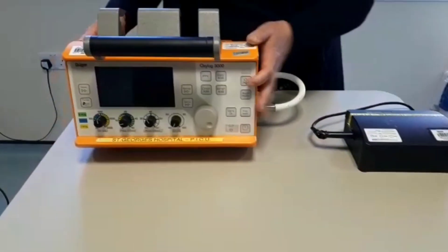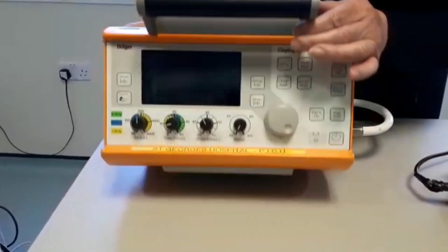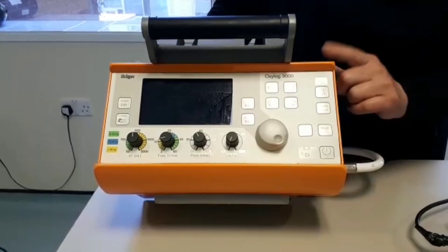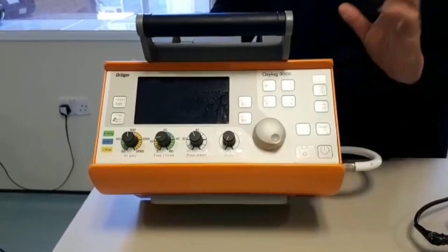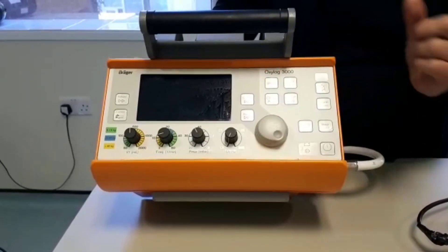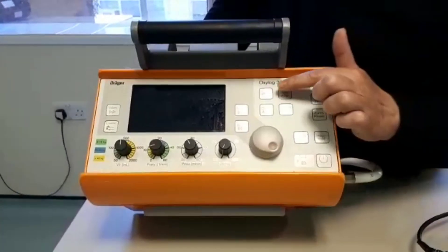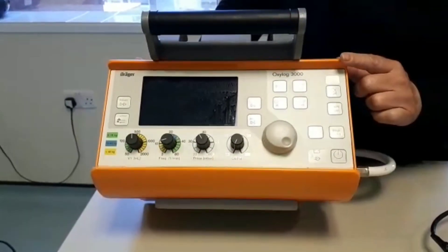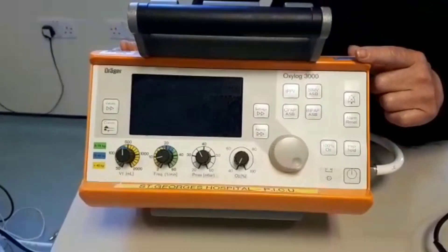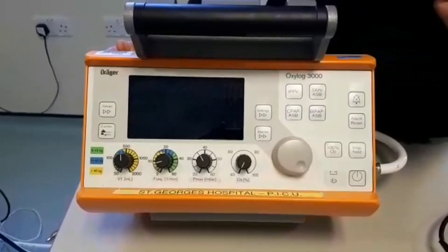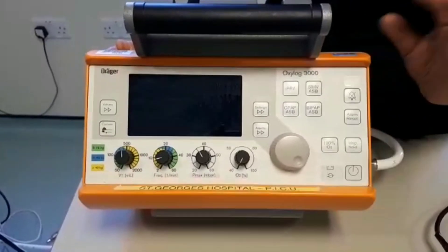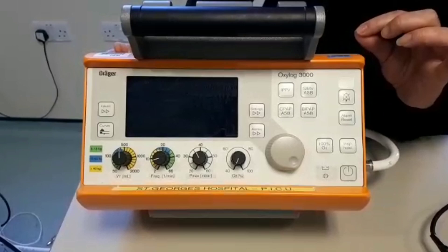I'm just going to quickly show you how to set up the Oxylog 3000 ventilator. We also have Oxylog 3000 Pluses in the trust. There's two differences between them. The Oxylog 3000 Plus has CMV rather than IPPV mode. And also, when you first turn the device on, it will display that you want to use an adult or pediatric circuit. But we'll show you that when I turn the device on. They're the only two differences you need to know about.